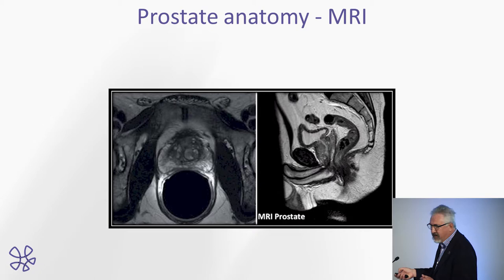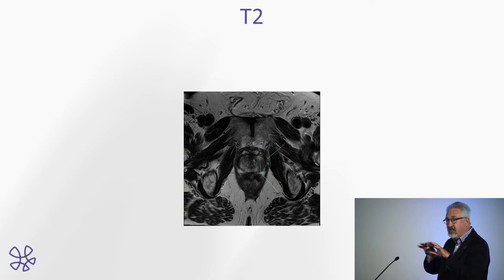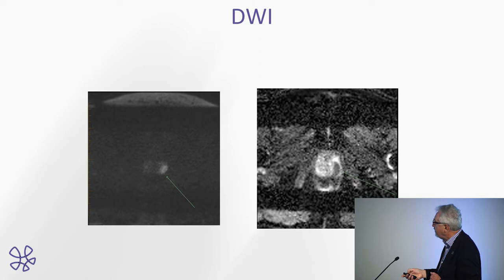And this bit of bone actually is hard because calcium destroys our MR signal. So this is why we need to put the power up into it. Here it is again. As we age, we get a lot of change in our prostate that makes it what we call heterogeneous, that the signals are variable. So we're trying to find the abnormal in an already heterogeneous signal, and we're looking for little small areas.